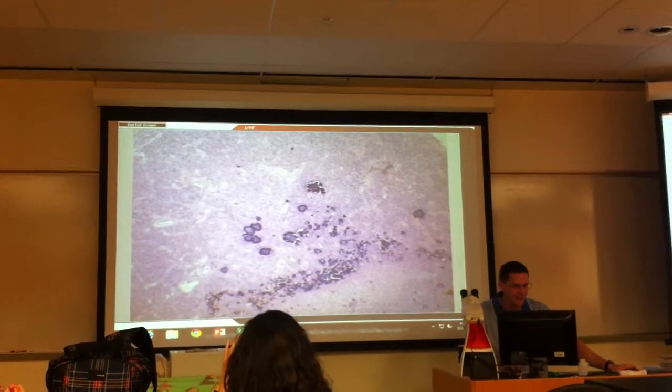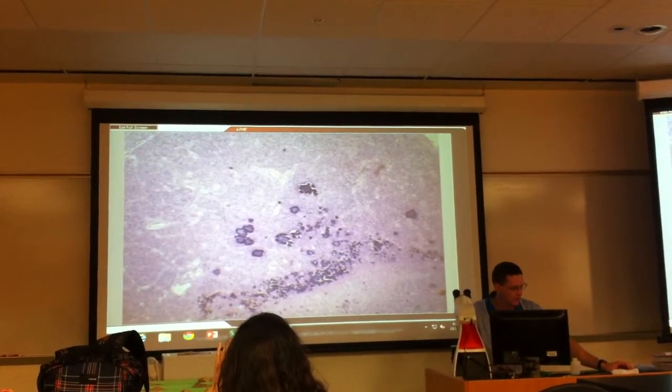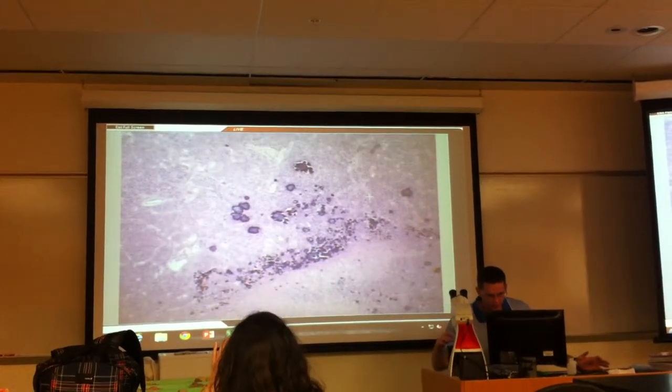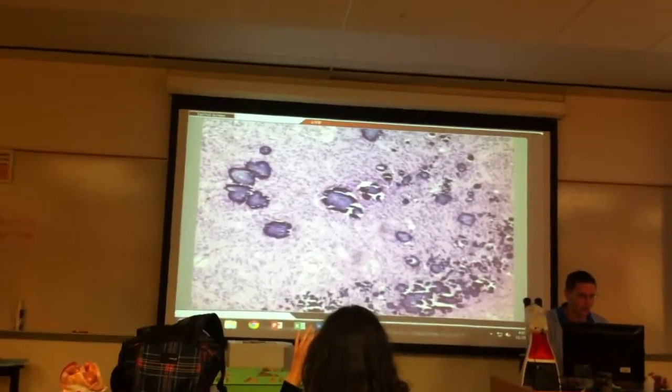And that means that every cell here is a pinealocyte. It's just crystals. I mean, there's nothing really special about it. But yeah, those crystals are brain sand.